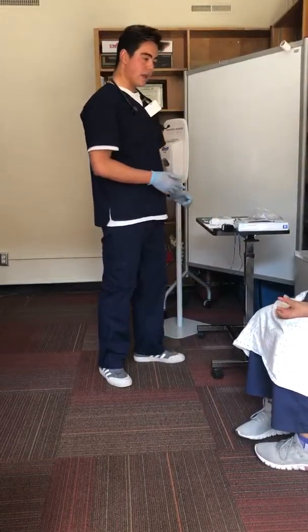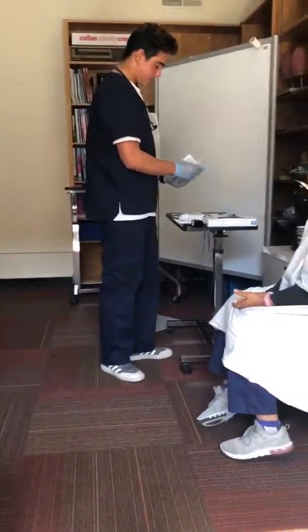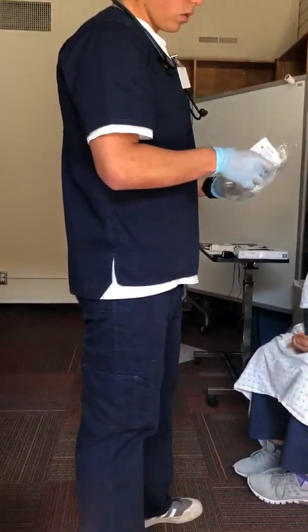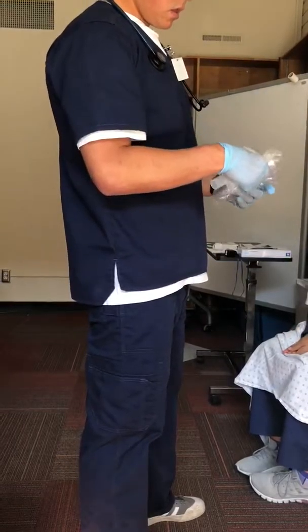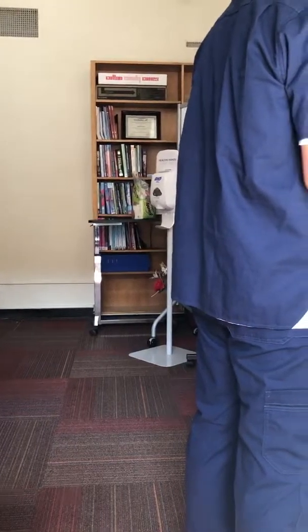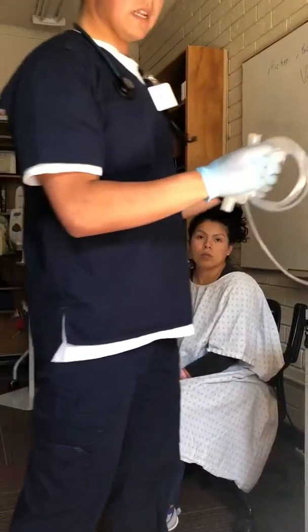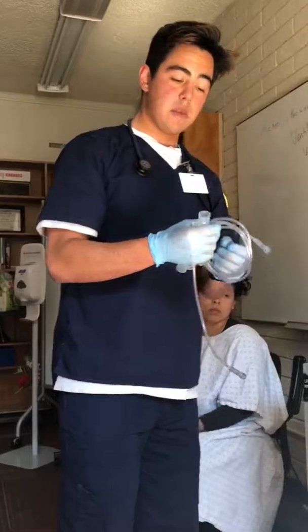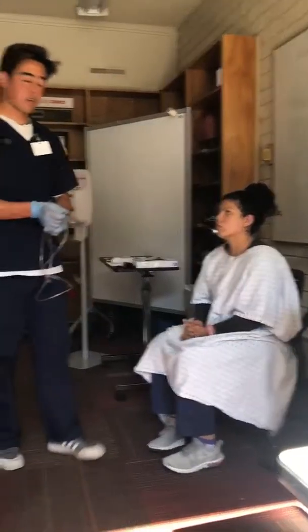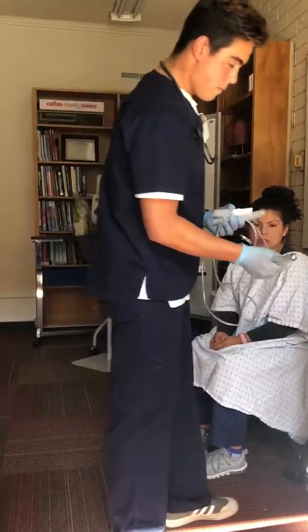Okay, so we're going to do our albuterol treatment now, okay? We're going to first set up the device. So we are going to be using this portable oxygen. We're going to open it up. And since our patient is alert and oriented and able to follow commands today, we're going to be able to use a mouthpiece. As the treatment is moving, we can assess how well they're using the mouthpiece. If they are unable to, we can use a mask for better effectiveness.